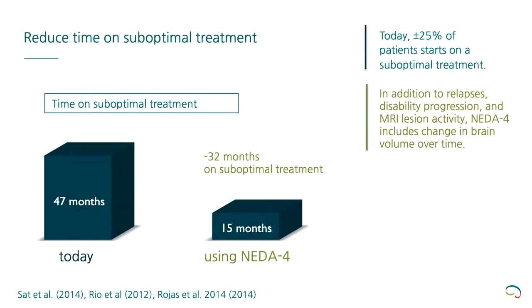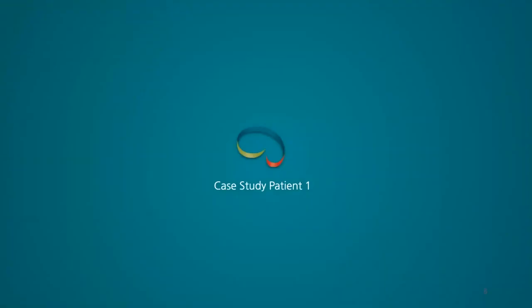So that ends the first part of the webinar, where I shortly introduced icobrain MS and its potential clinical value. We will now continue with some case studies that will be presented by Professor Nagels of the University Hospital of Brussels.